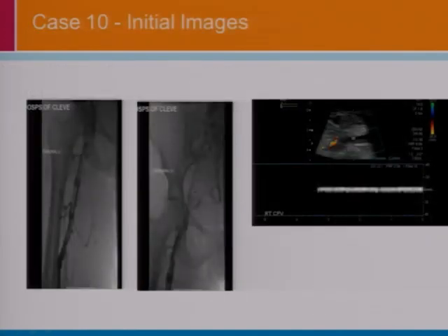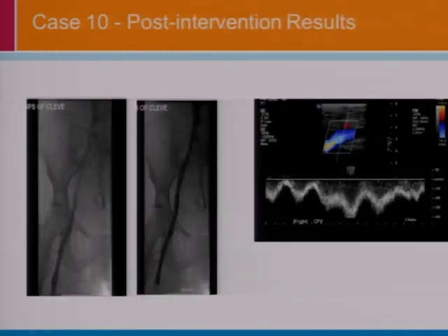You can see this is our venogram. She's got thrombus in her femoral vein and her common femoral vein, but when you look up in her pelvis, she's got clips, she's got a very small atretic iliac vein, and in the interest of palliation, we took her and did some pharmacomechanical thrombectomy here. We stented the obstructed portion, and you can see after we did our work, we've returned normal venous outflow. Her leg was better. This was palliative in nature for her, but she was quite appreciative.